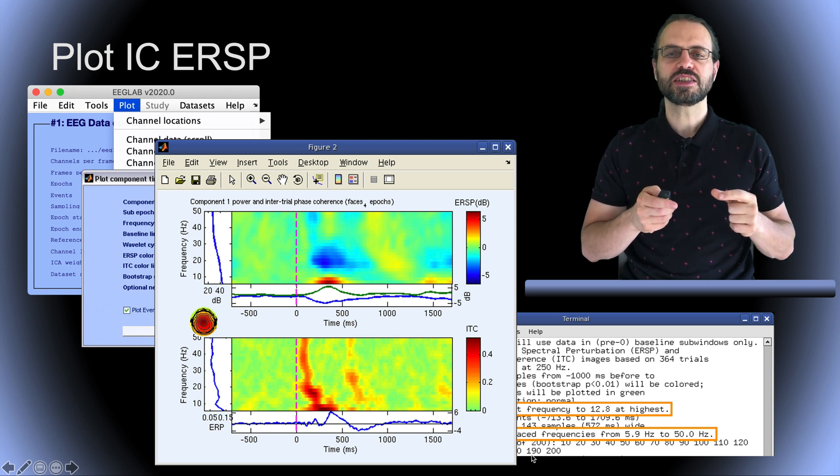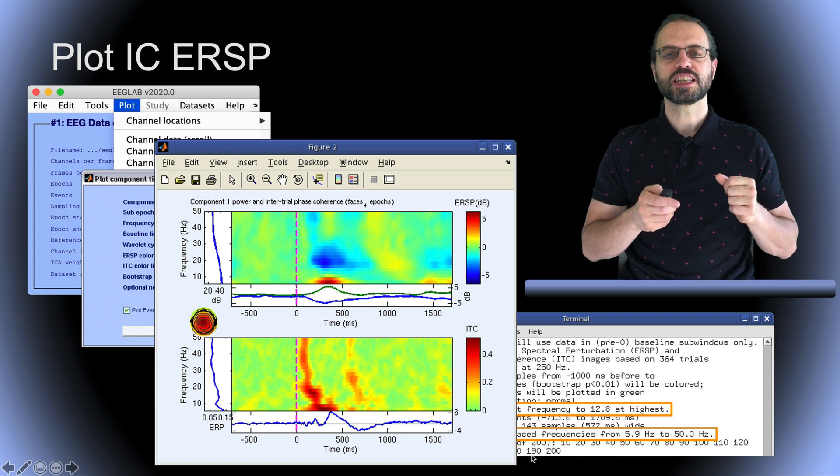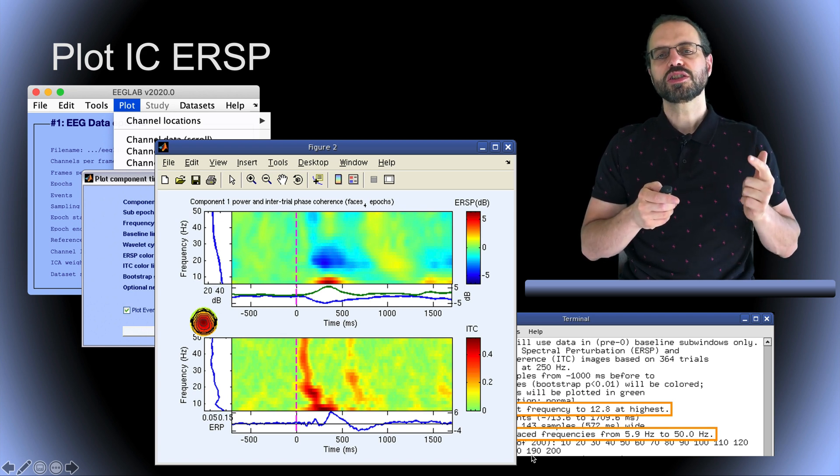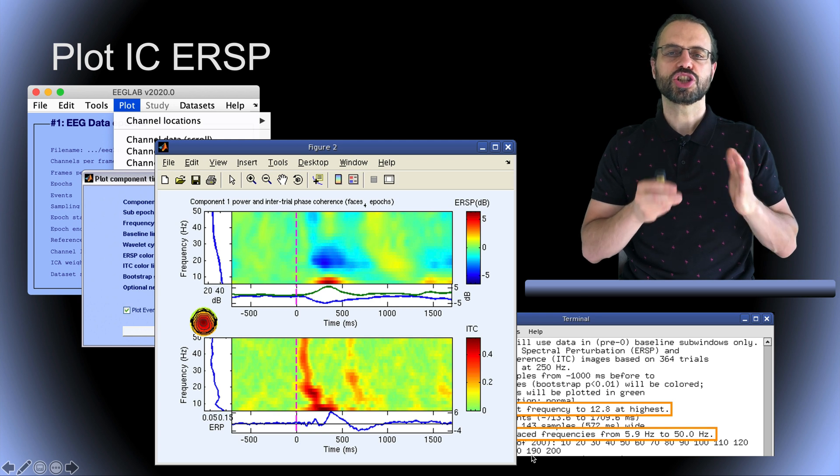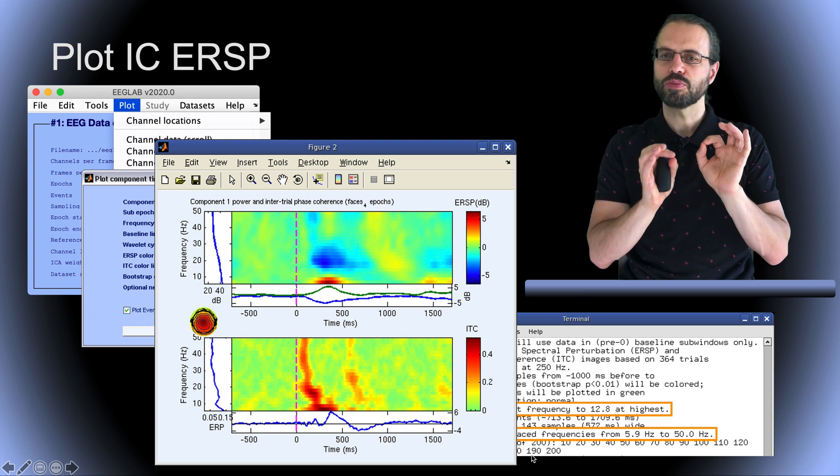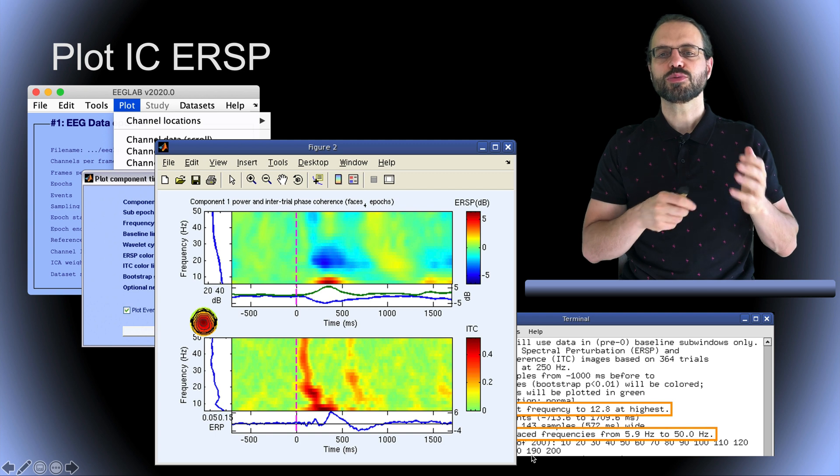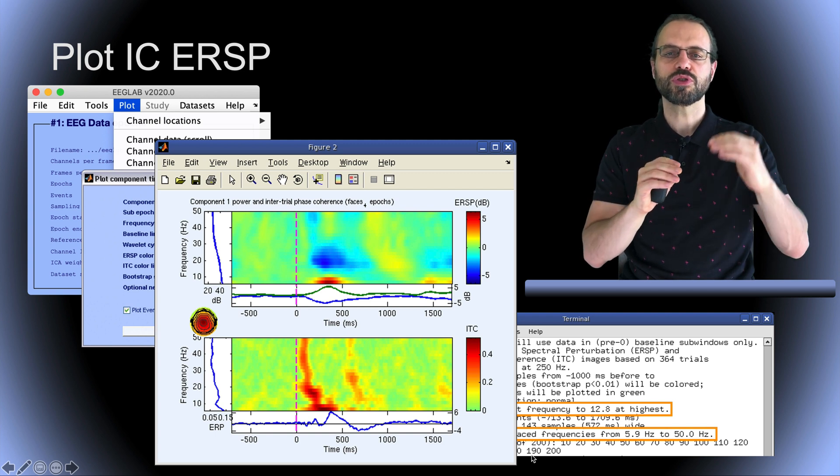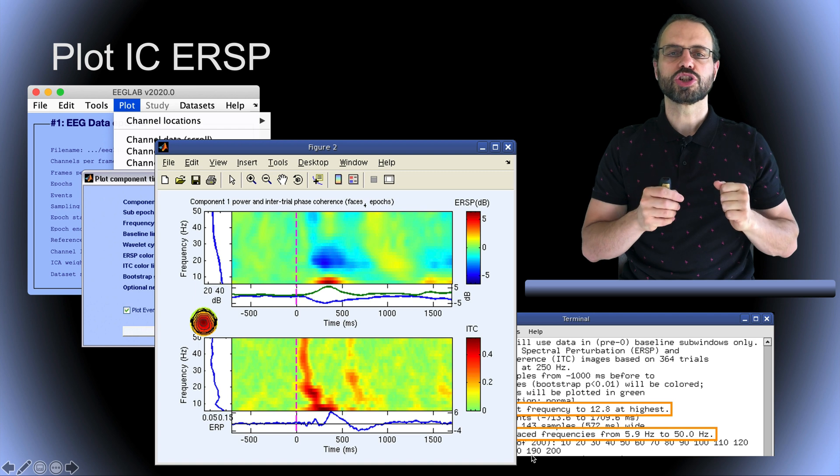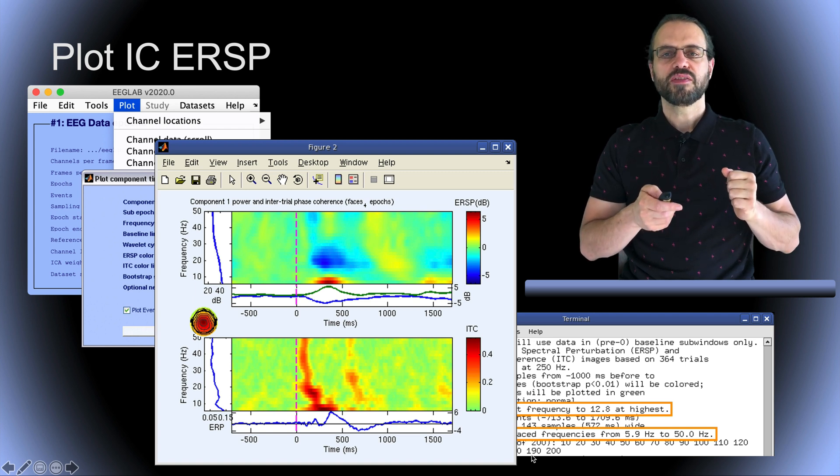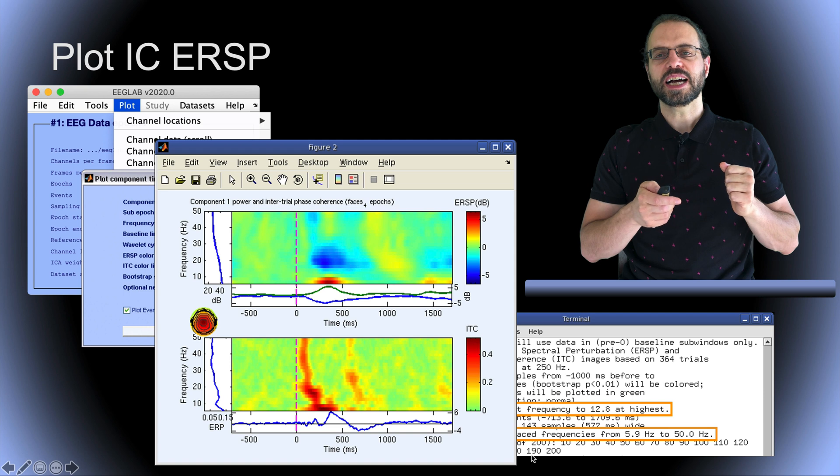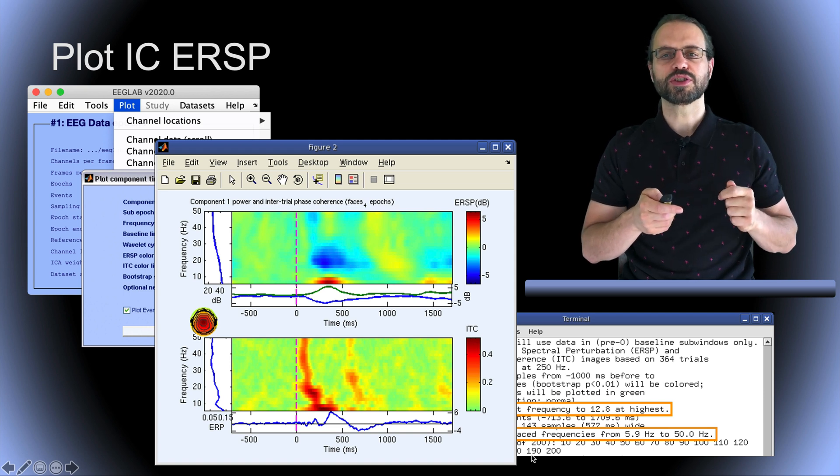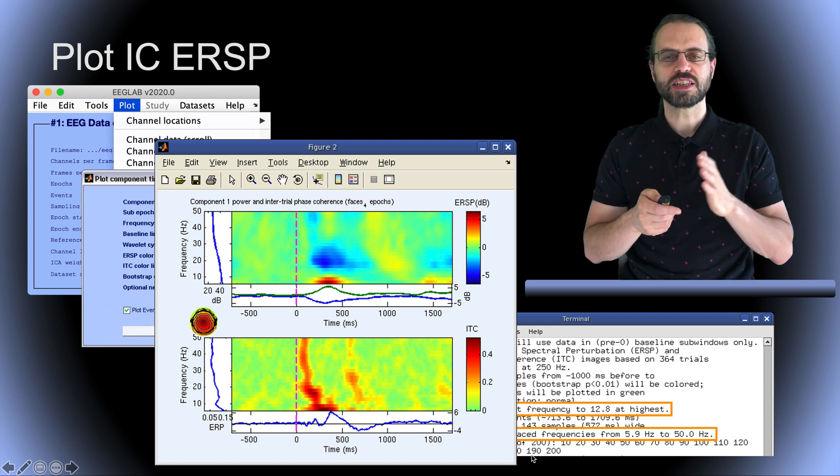For the ITC, we can see broadband activity at about 100 ms, which usually indicates a sharp peak present in most trials, so a true ERP peak. This is because, as we saw in one of the previous presentations, we need all the frequencies to model a sharp peak in the input signal. Then we can also have ITC activations at frequencies observed in the power spectrum, although at somewhat different latencies.